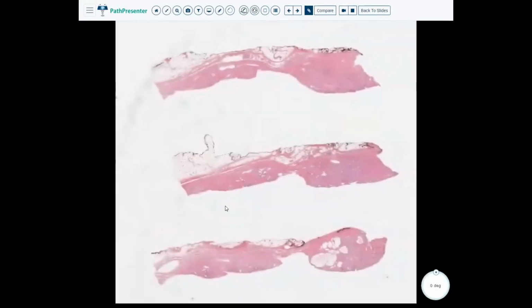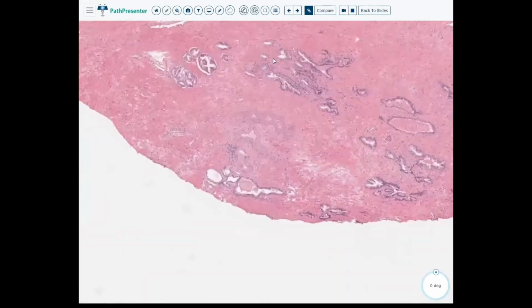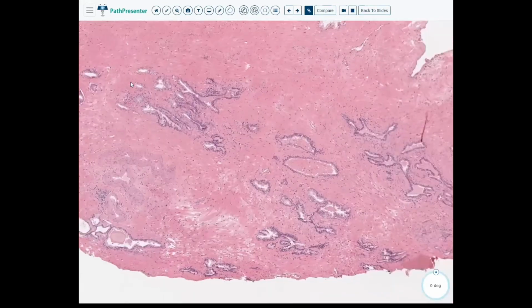Moving on to malignant lesions of the prostate. So again, this very likely is a resection. We have ink, we have fat, and okay, you can see a little bit of blue in some areas, so let's just quickly go through.